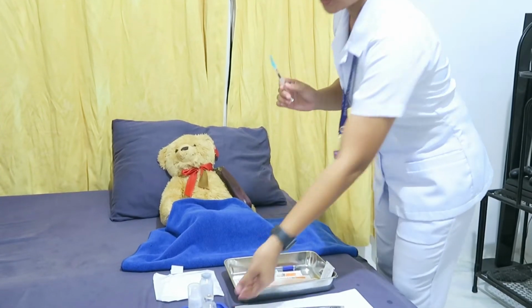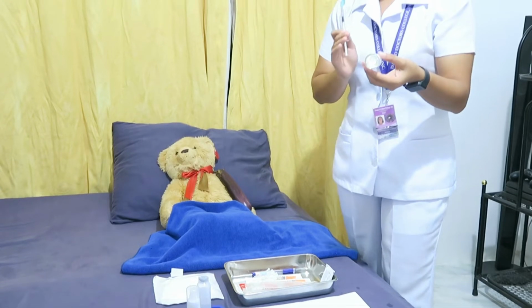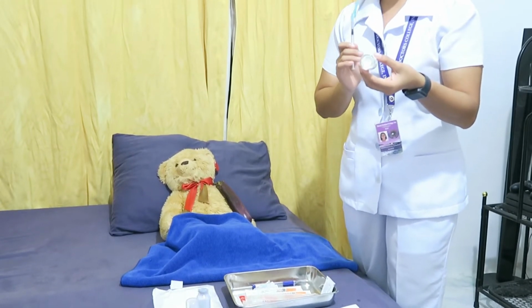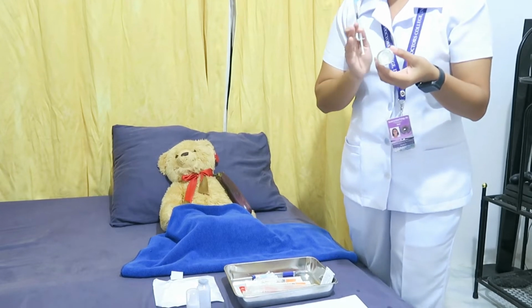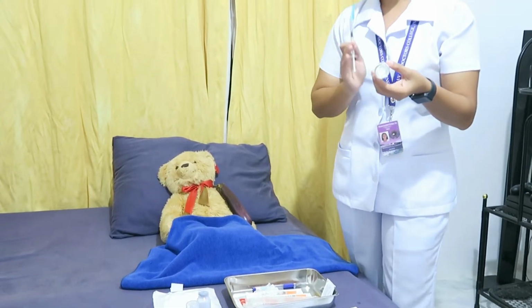After that, the next procedure is to hold the vial down. So this is the vial. Then move the needle tip so that it is below the fluid level and withdraw the medication. And after that, invert the vial to ensure the needle tip is below the fluid level and gradually withdraw the medication. The rationale for this is that the bevel is kept up to avoid creating bubbles in the medication.